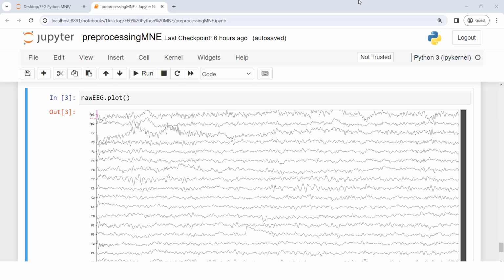Yes, my friends, visual inspection is important. As sophisticated as algorithms and tools may be, the human eye remains a powerful instrument for identifying patterns and anomalies. First, we begin by reviewing the pre-processed data. This involves examining the entire dataset, paying close attention to areas where artifacts may still persist.